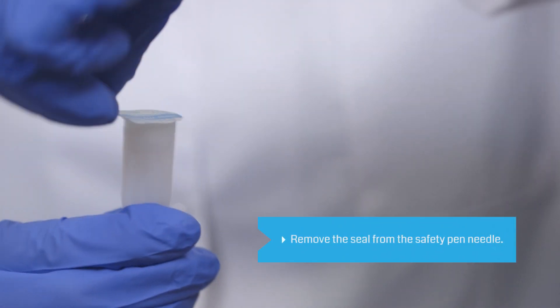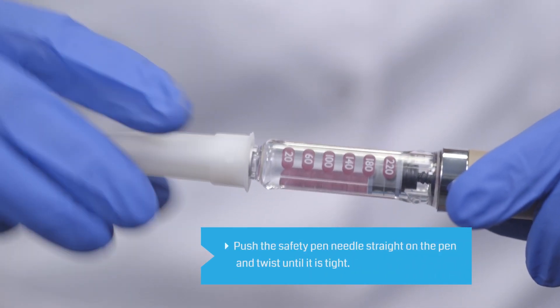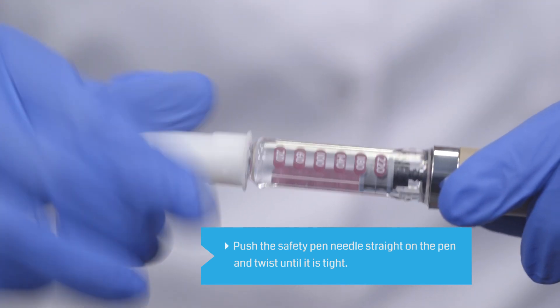Carefully remove the seal from the safety pen needle. Push the safety pen needle onto the pin and twist until it is tightly attached.